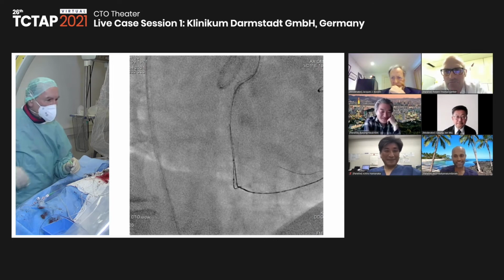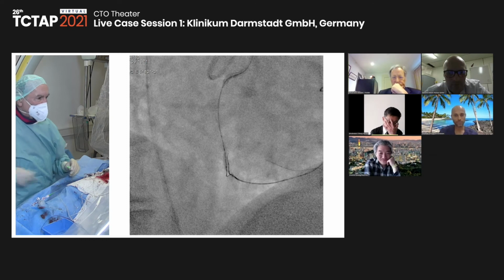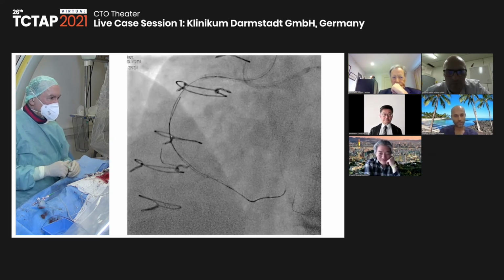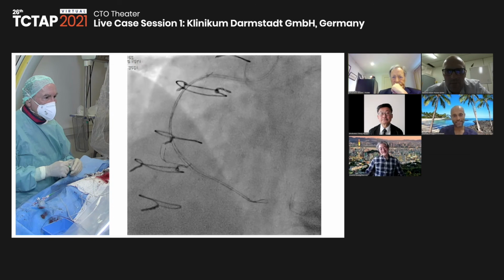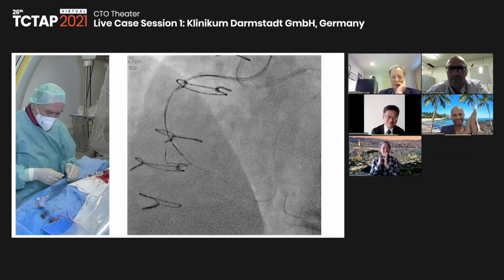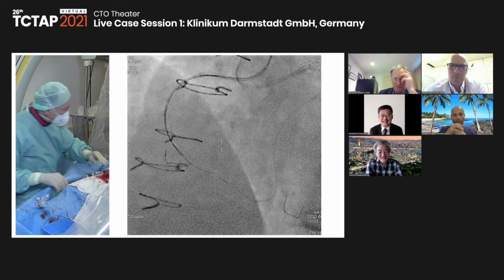So that's very important, to go to the frontal plane here when you deviate, and you see also in the B plane that we are actually overlapping. And maybe we save now some money. Yes, sir. Sweet, perfect. Strong work. The old guys still do it. Okay, great. Wir sind durchgekommen, Herr Pioch.